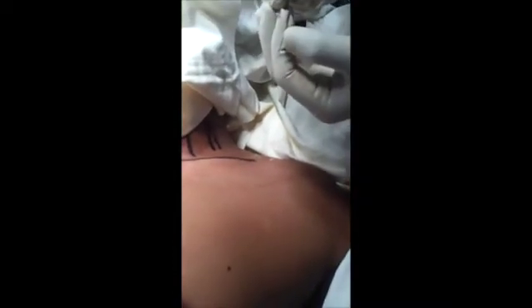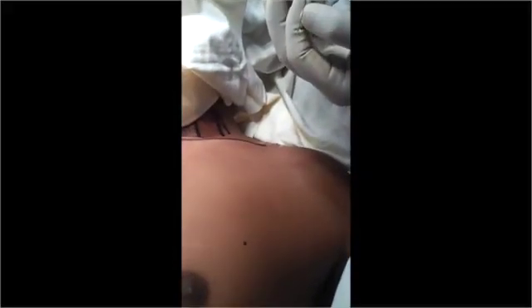We are assessing the interscalene block. The needle insertion process covered around 1.5 centimeters. This is the block assessment at around 30 minutes. The patient is not able to raise the shoulder. The radial nerve is blocked — there is wrist drop on extension, because the muscular function is gone.